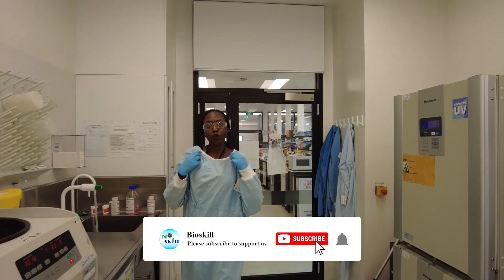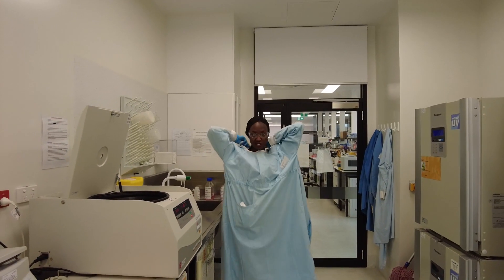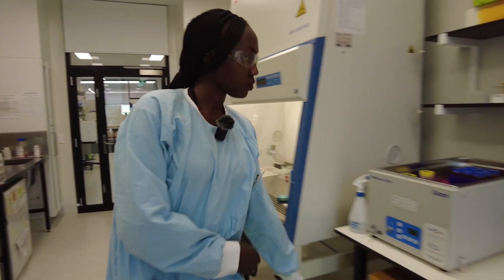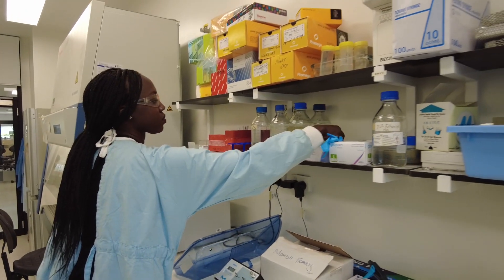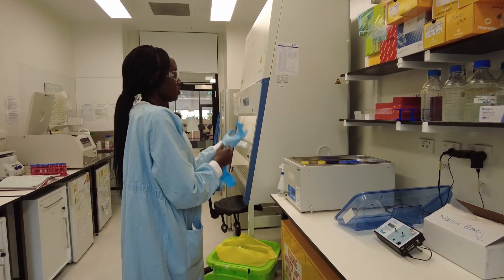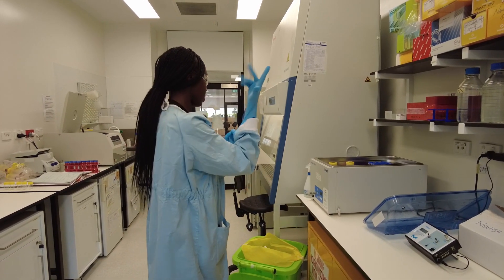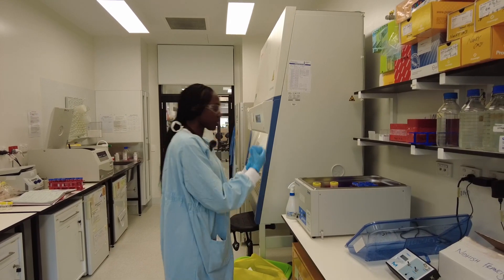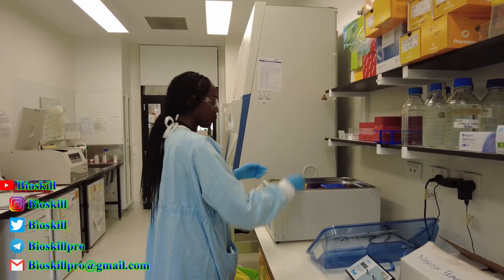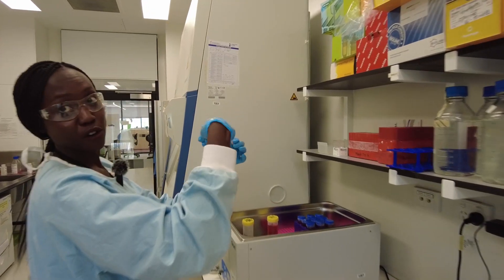This is a clean room lab coat — whatever was in the liquid nitrogen, we just reduce the likelihood of contamination. I change my gloves, and after putting on the clean room gown and new gloves and ethanol all over my gloves, we get the vial and put this much in the water bath and we rapidly defrost.